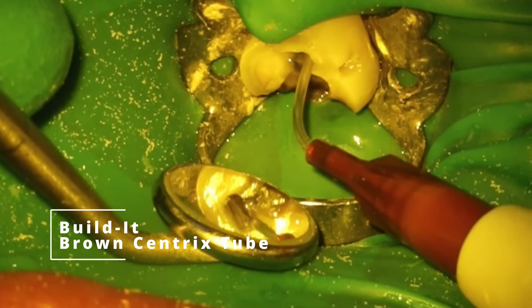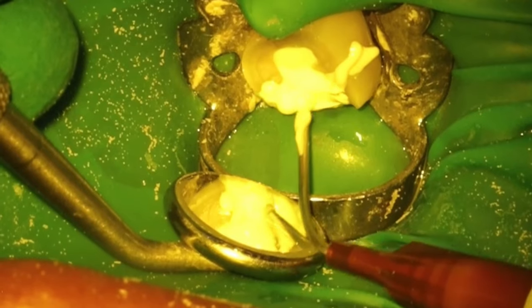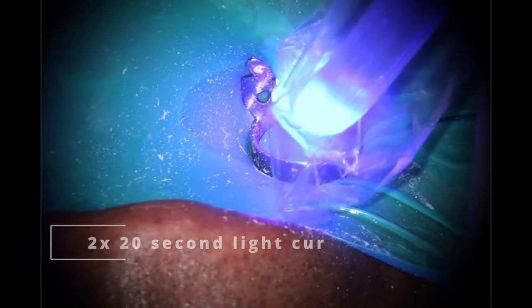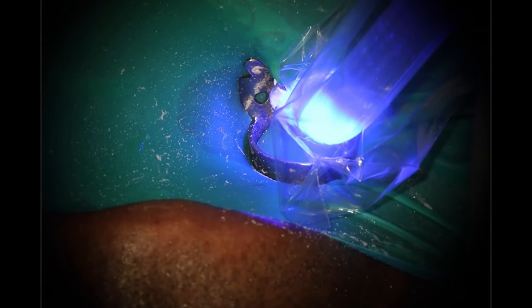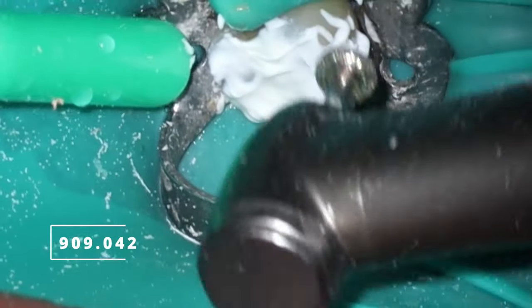Unfortunately, most general dentists these days don't love amalgam — which breaks my heart. I actually bought enough amalgam to last the rest of my career. At this point I do amalgam on friends, family members, and to close up gold crowns. Everything else is composite, which is still a great material. Going to smooth everything out with the Glick. That buccal pit didn't have caries, but I have had times where a buccal pit had decay I wasn't aware of and left it — and got a nasty call from the dentist. My recommendation: if you're doing the restorative, take out everything and give them a nice clean surface. I did a longer cure on this one — whenever there's a large amount of composite I like to do two 20-second cures, one buccal and one lingual, to ensure a complete set.